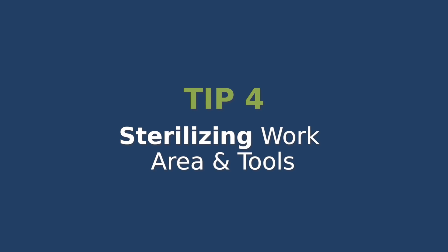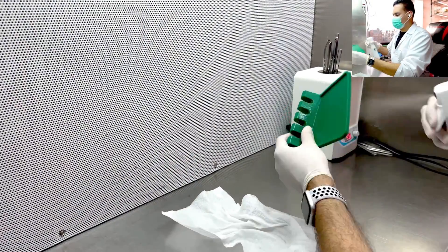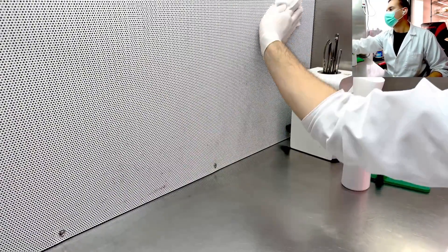Sterilizing your work area and tools. Now let's talk about sterilizing your workspace and tools. Wipe down all the surfaces with alcohol or bleach, and don't forget to heat-sterilize your tools. You can do this with an alcohol lamp or with a glass bead sterilizer. This reduces the risk of introducing contamination into your cultures. Sterility is the key to success.